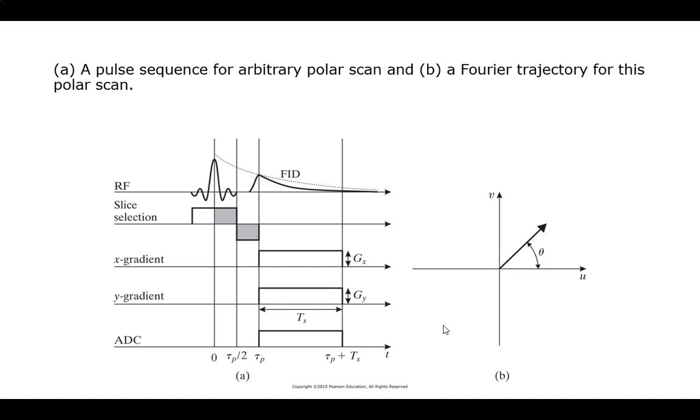Now we're going to want to measure some angle. How do I get that? So again, this is a single line starting from the origin. You're moving in X and Y. If you just think for a sec, that means I've got to be pushing X and Y. I've got to uniformly perturb those so they start spreading out. So it's just a tilted plane.